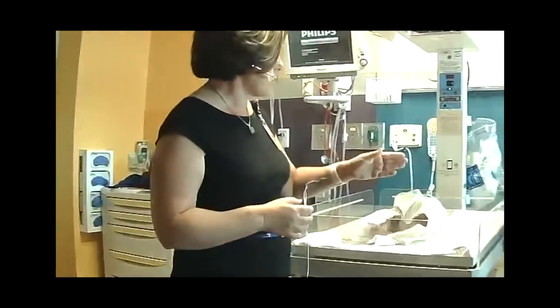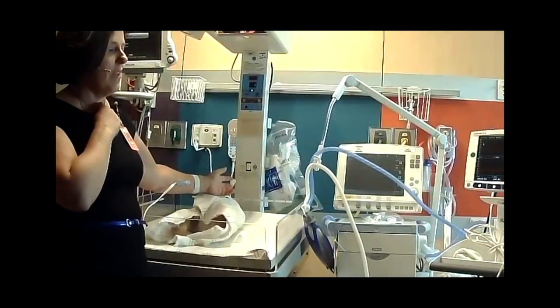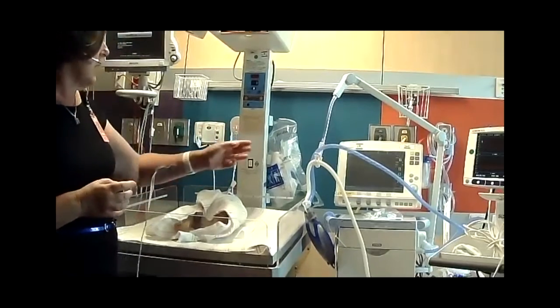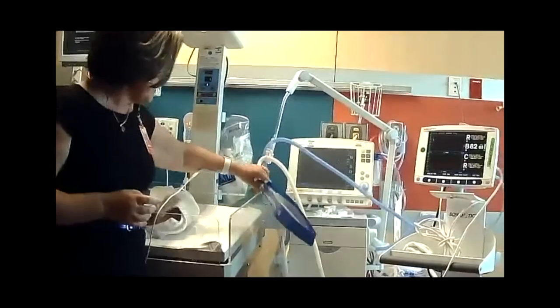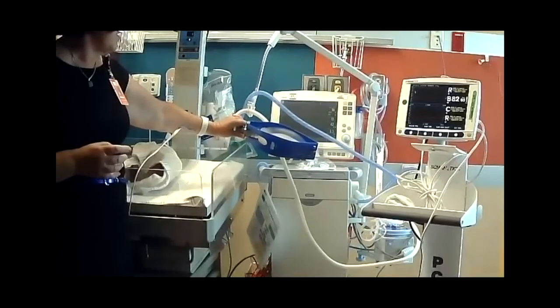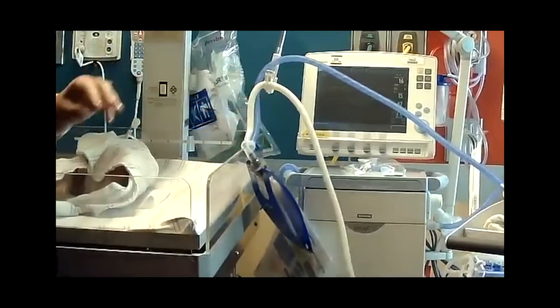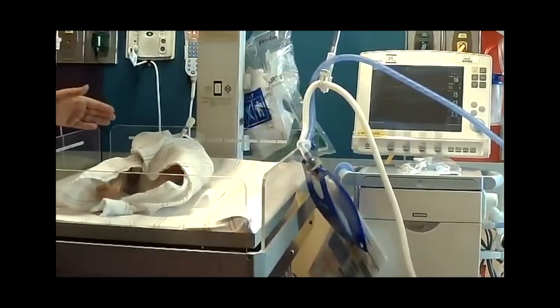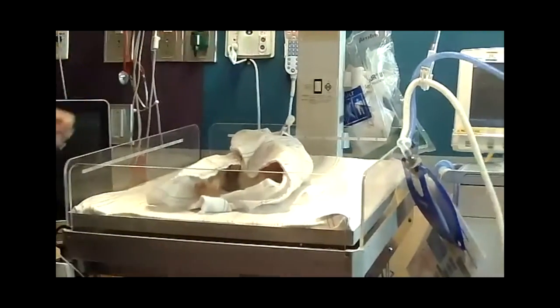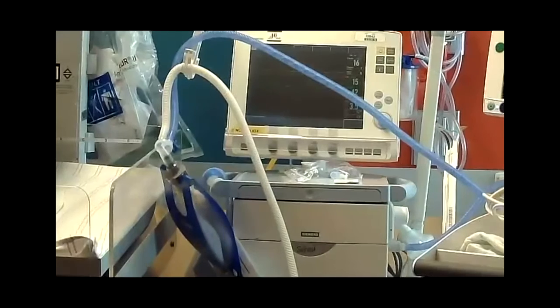So this is the ventilator. Normally it is attached to this endotracheal tube that bypasses the vocal cord. So when you're on the ventilator, you cannot talk. If you hear a lot of noise and sound, the tube could be out of place. We have it hooked up currently to what we call a test lung. So it's giving breath, do you see that going up and down? It breathes in, and then the air comes out. So that's what we're doing. We're giving a breath and then exhale, breath, then exhale. How we turn it down is watching how much you need. We'll actually watch on it, and you can see when you initiate a breath on this green line, you'll actually see a little purple spike, all right, that shows the baby's taking a breath.